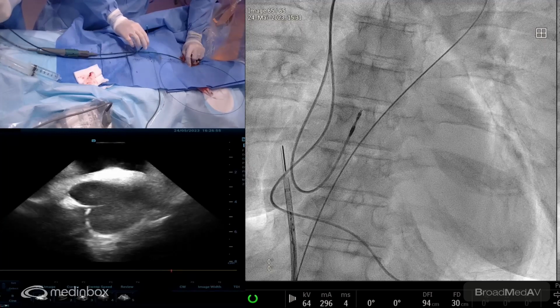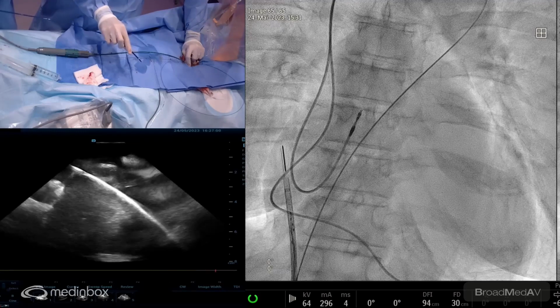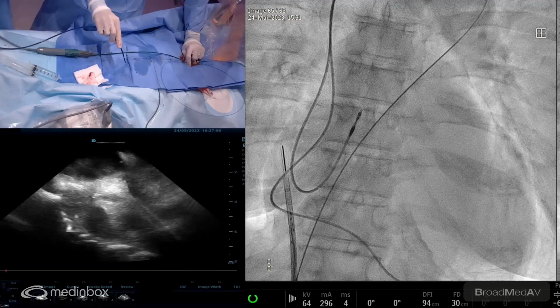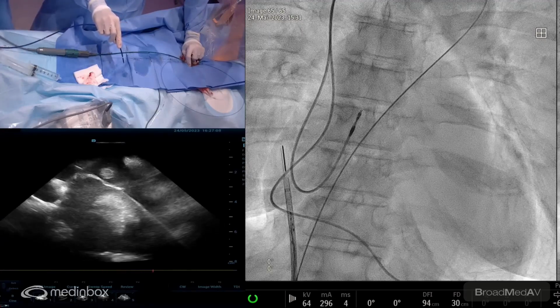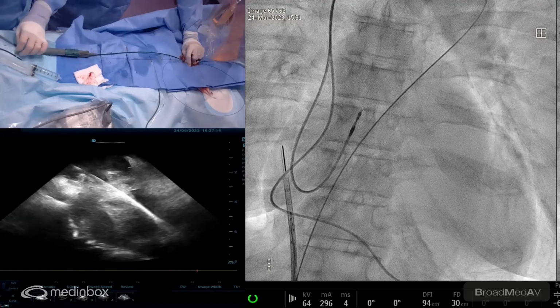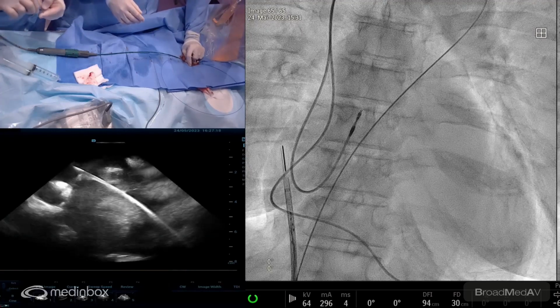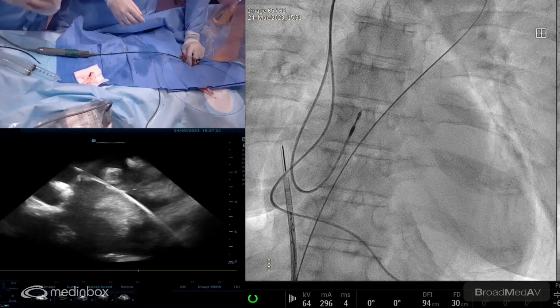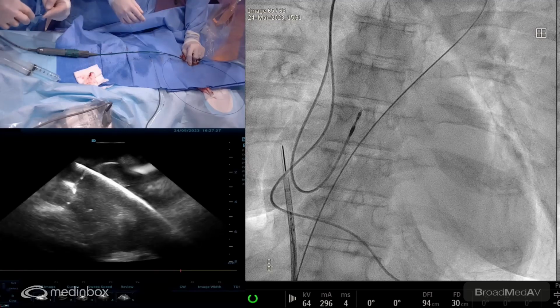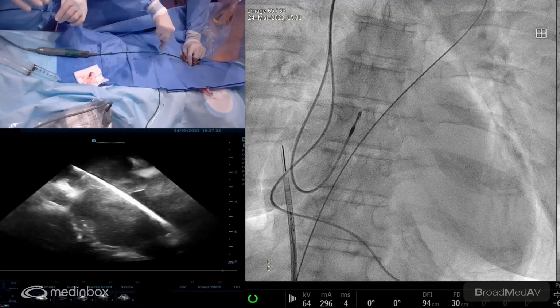Typically, after closure, we need to give at least one antiplatelet agent, and it's at least aspirin. We often add a second one, often Plavix for 3 months, but it's mostly empiric, to be honest, to minimize the chance of a clot on the device, but also to minimize the risk of migraine after a procedure. It was well proved after PFO occlusion. If we give two antiplatelet agents, we have less migraine. Migraines are typically caused by platelets going on the device, because platelets are full of serotonin, and when they release their serotonin, it can cause migraine.